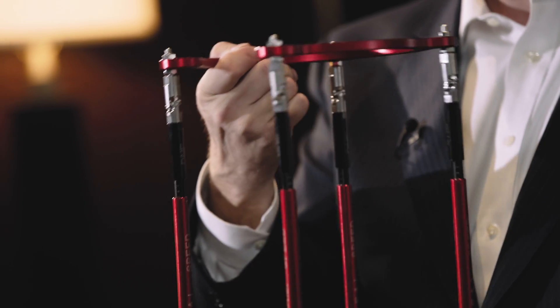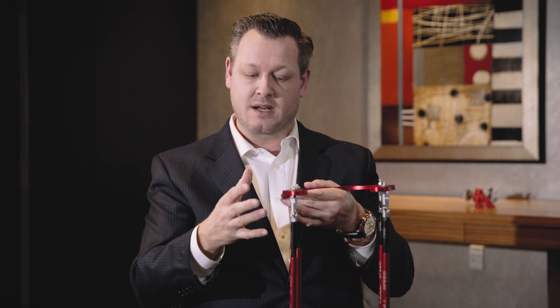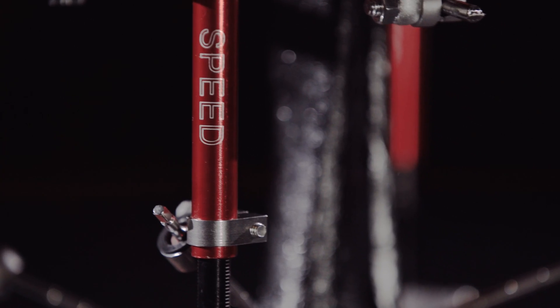Once you have the frame fixated to your pathology, you can actually remove portions of the frame without hindering your basic construct or your unique advanced reduction, and start manipulating elements of the frame.